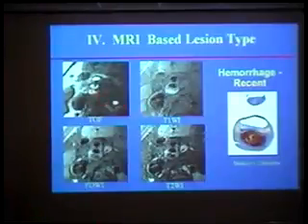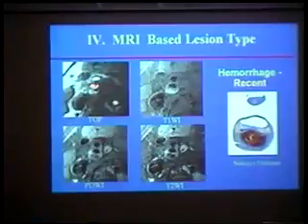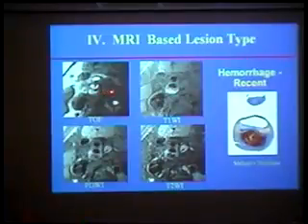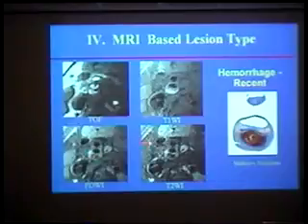This is what you see on time-of-flight images. Interestingly, this region where the hemorrhage is looks about as bright as what the lumen would look like. So if you don't have black blood images like this to tell you what this is, people may actually interpret this image by saying that there are two lumens in this. The flow is flowing there and also there. But this region really is hemorrhage. And it's actually showing very differently on the other contrast weightings.